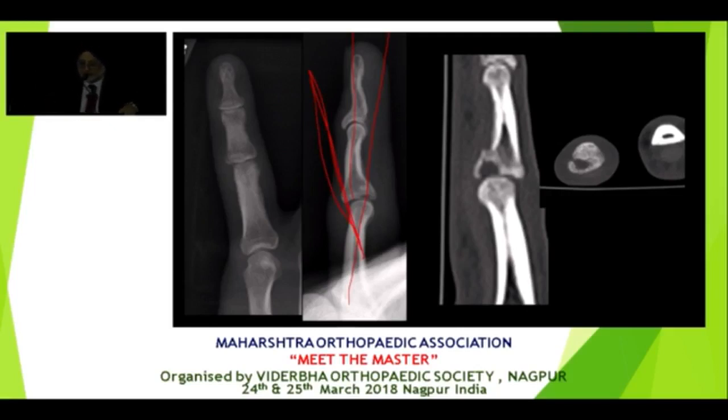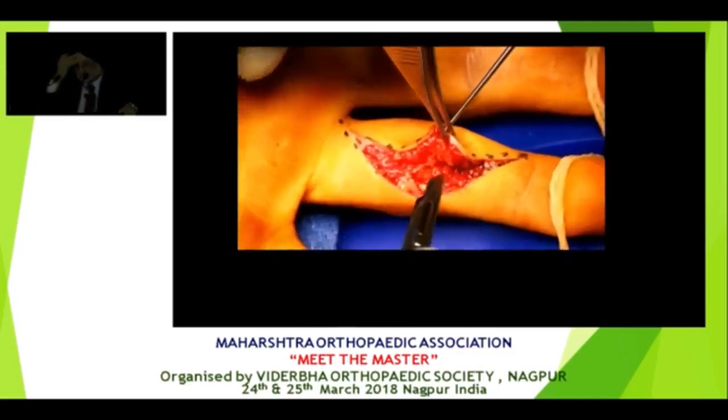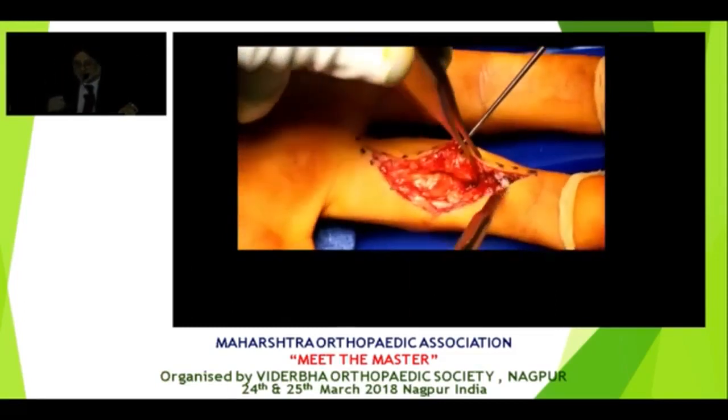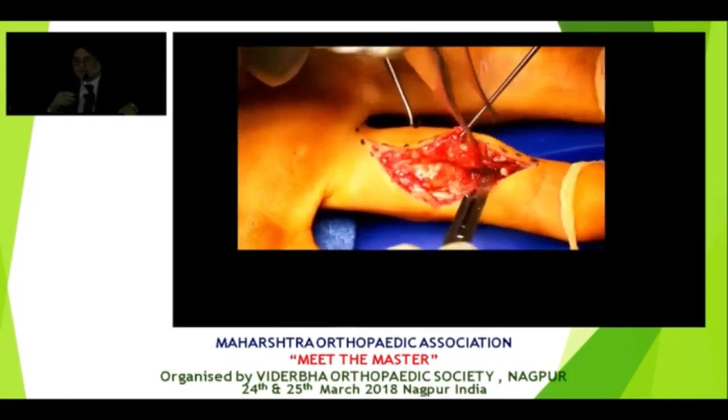What I find is, if you look at the CT scan on the cross section, there's depression in one corner, no depression there. So I find that if you don't correct the depression, when these people make a fist, the finger rotates because it falls into the depression area. So this is an open reduction of these fractures. This is probably the most technically difficult operation in hand surgery.